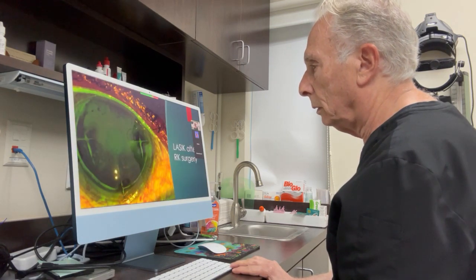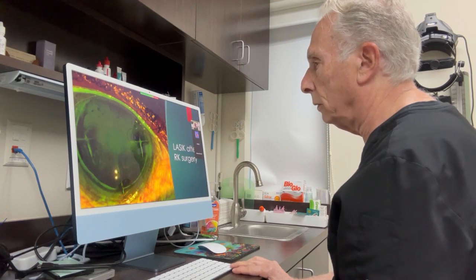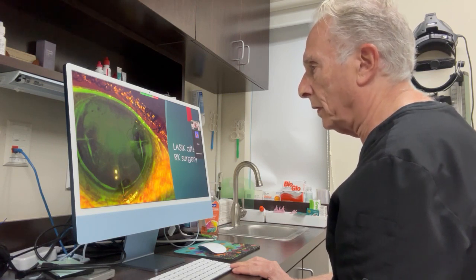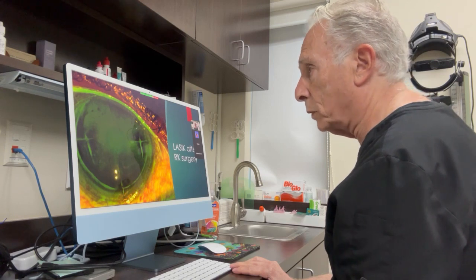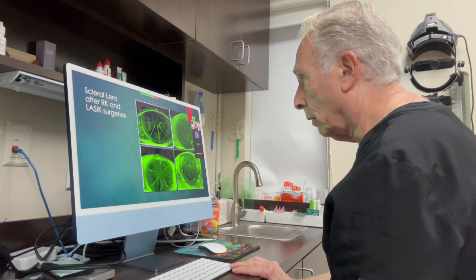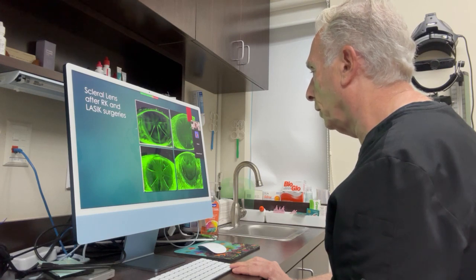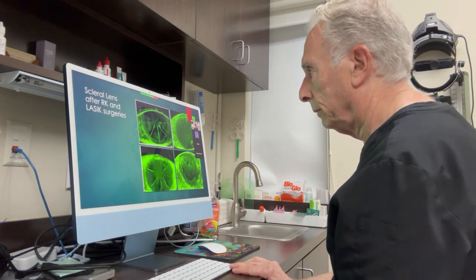Here's another eye that underwent RK surgery followed by LASIK surgery many years later. I've never seen anyone who had multiple surgeries come out on top of this. Usually what they call enhancements make things worse. Here are multiple corneas of eyes that underwent LASIK surgery after RK surgery. All of these people needed scleral lenses, all of them.